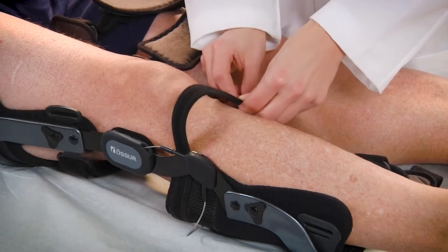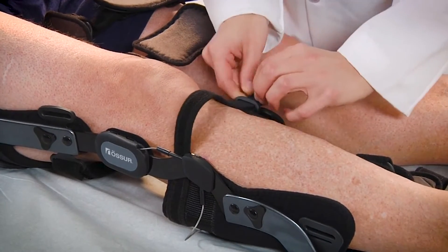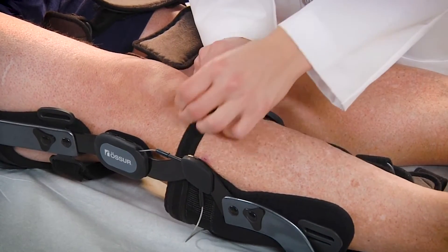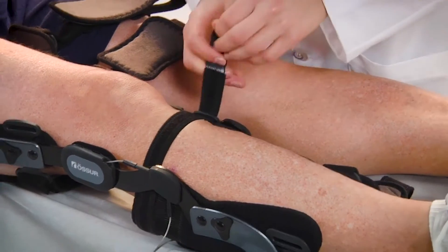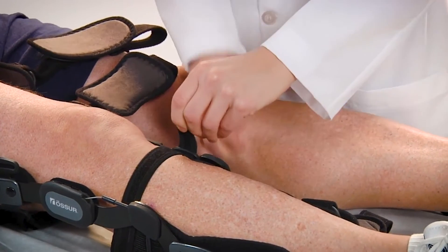Start by fastening the AMS strap snugly to aid in brace suspension. Note, all straps can be adjusted and/or trimmed to length.